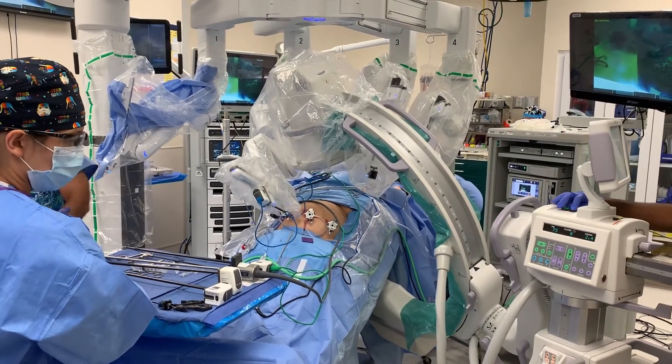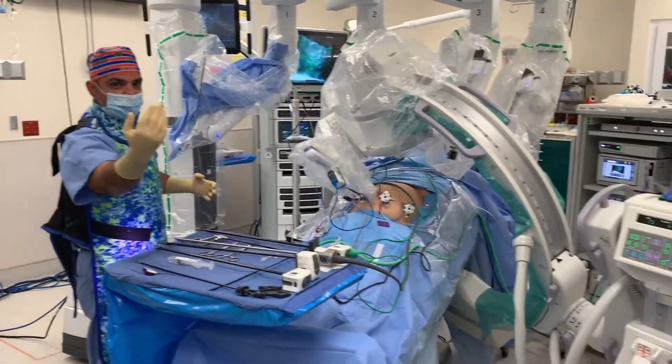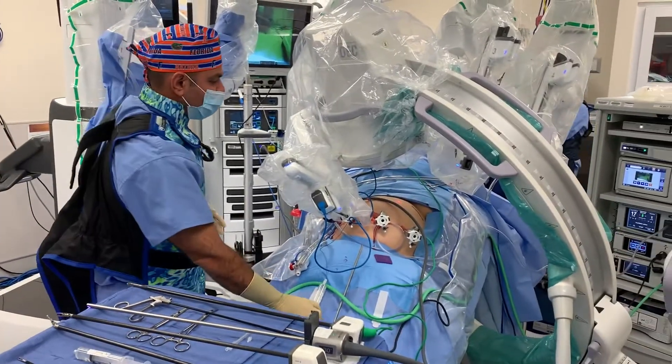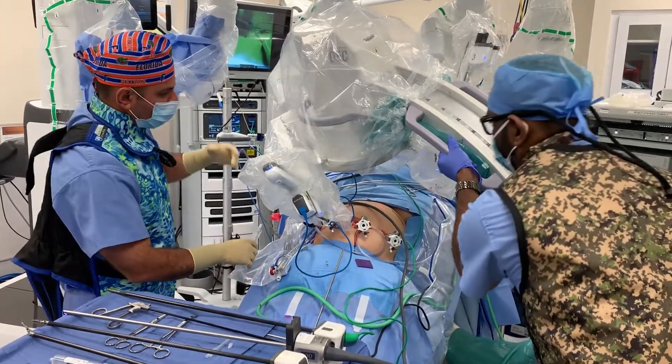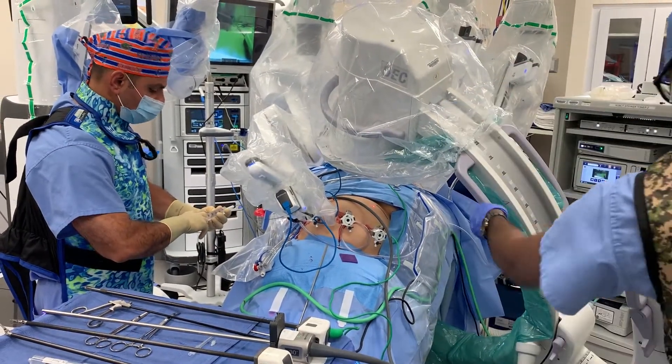I have Dr. Lola here, who is one of our new interns, and I'm essentially showing her how this is performed, so I hope that she will be able to perform this at the bedside and eventually perform the whole procedure.